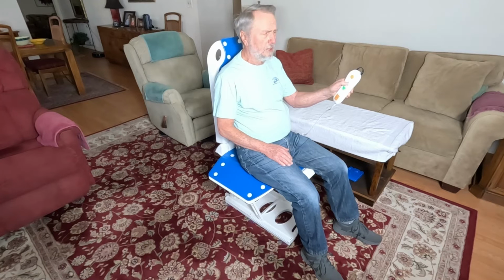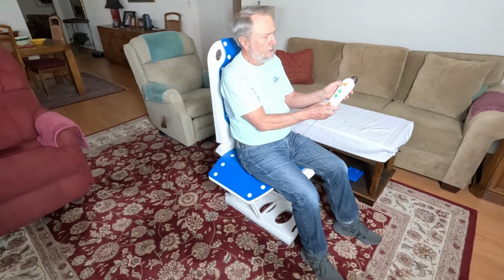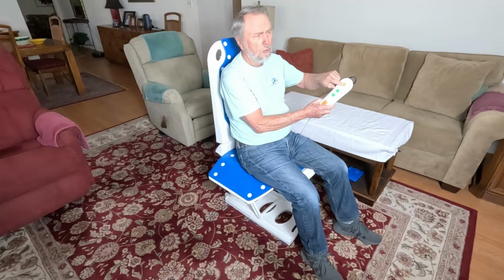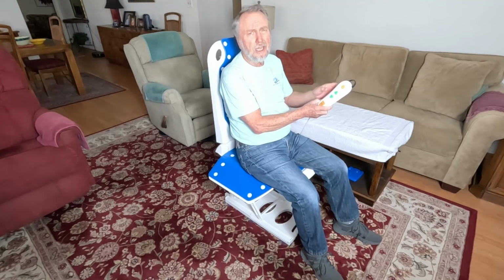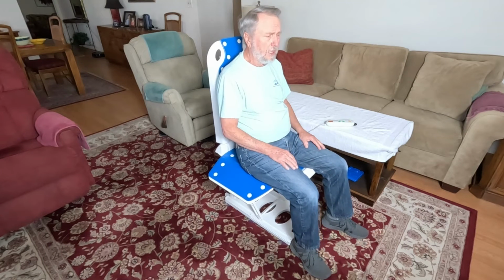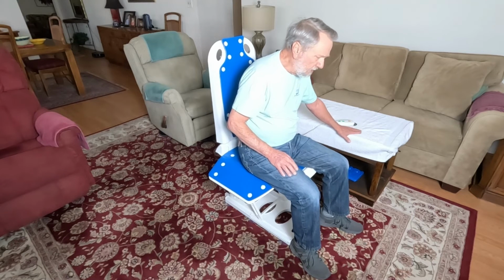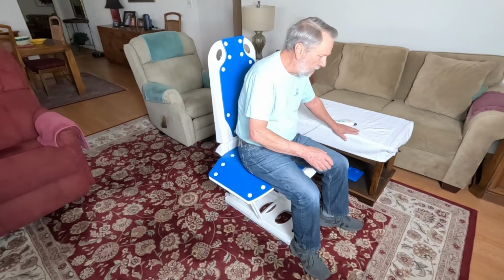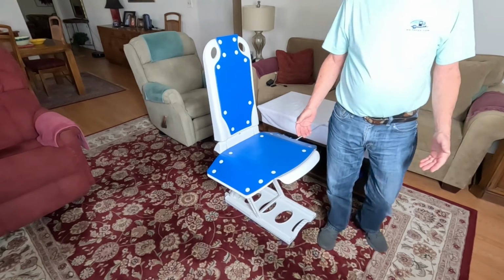Now I'm holding it, and there's a green light on showing that it's activated. Now this is a power off. If you push this button while you've got the button going up, it'll shut it down and all the power shuts off. Okay, I'm up now, and when I get ready, I can attempt to stand. And I'm going to use this, and that's why it's nice to have something close by. And I'm ready to go.